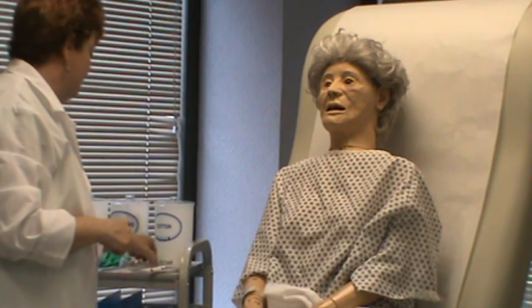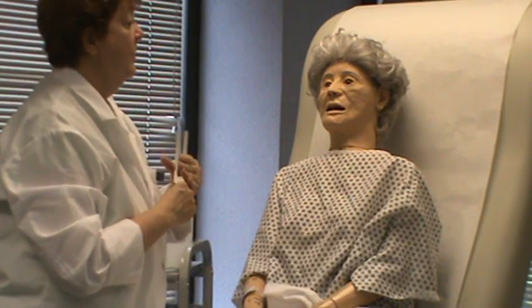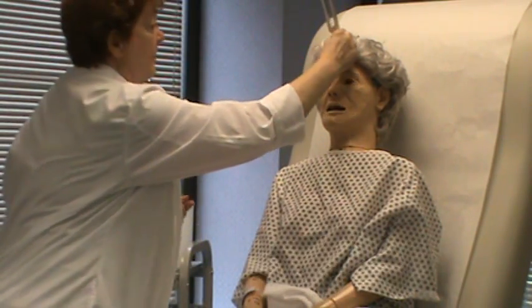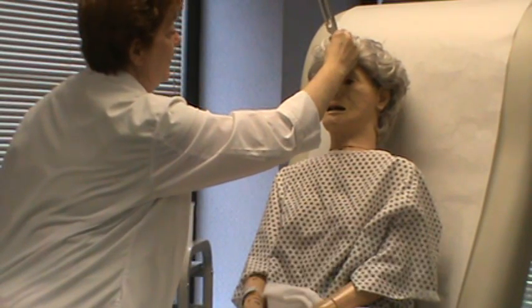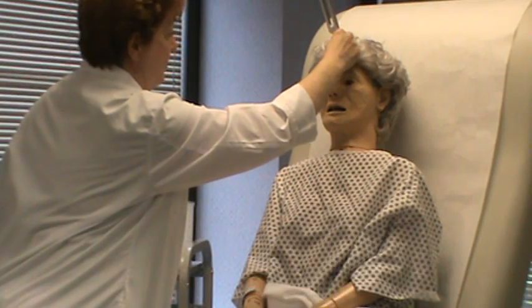Now the others, I will check for her hearing with the tuning fork. Because she has a hearing problem, I would expect that she would be following up to check on her last exam when she's been seen. I want to check with the Weber test and ask, can you tell me if you hear it in both sides? And she says yes, to see if it's symmetrical.